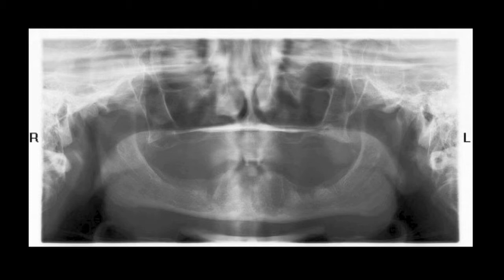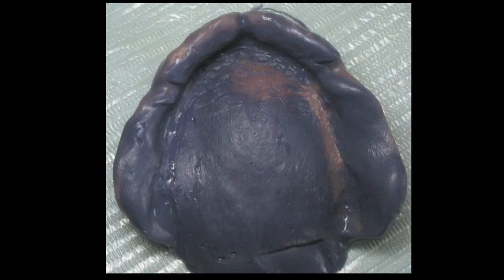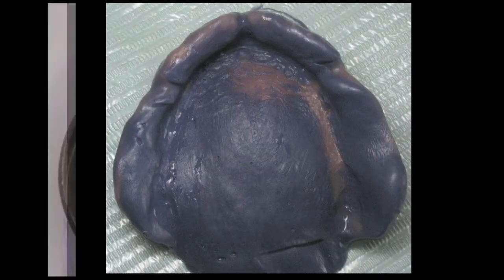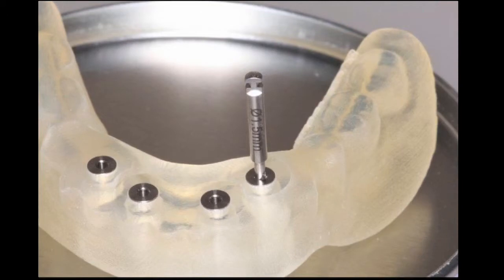Radiographically, there was bilateral pneumatization of the maxillary sinus. Prior to obtaining the CT scan, a reline impression with Impregum was taken and the dentures were sent to Glidewell. From that set of impressions, an upper and lower dual scan appliance was fabricated. It is important to note that the more accurate the impression for the scan appliance, the more accurate the surgical guide will be. Any reduction in the movement of the surgical guide will increase the accuracy of the final implant placement.